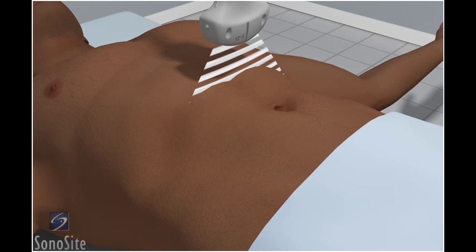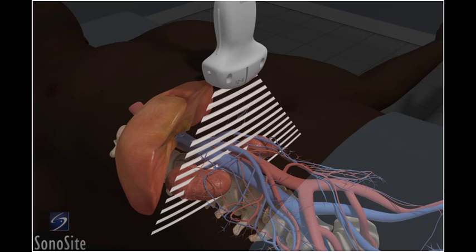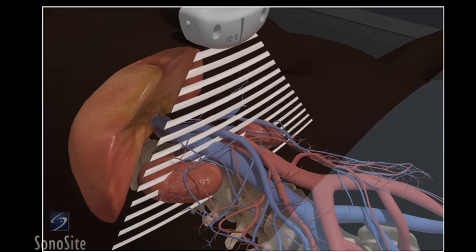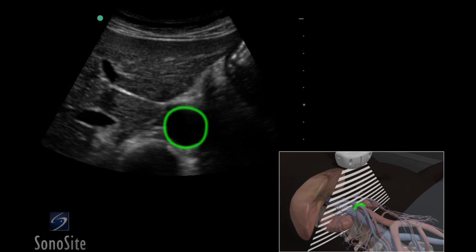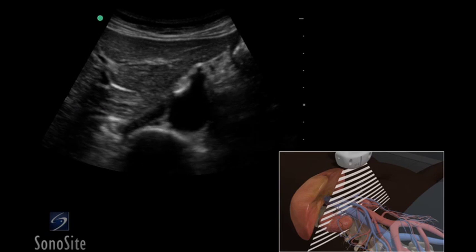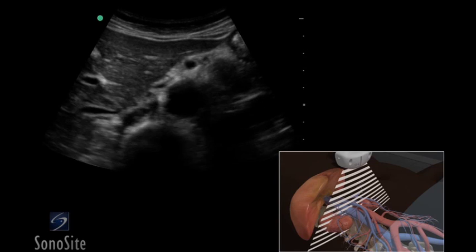The examination begins with the transducer placed transversely in the epigastric midline with the marker directed to the patient's right. The aorta is seen as a round, pulsatile structure anterior to the bright reflection of the vertebra. The vena cava is an oval structure immediately to the left of the aorta on the screen, which changes in caliber with compression or deep inspiration.